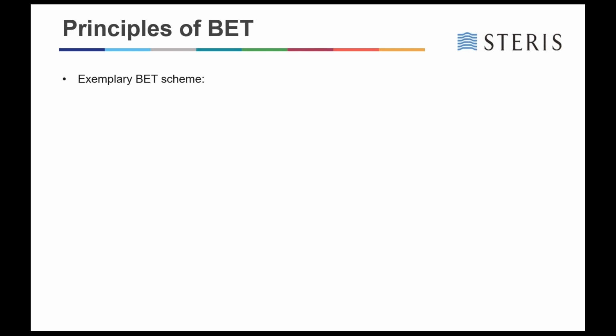Okay, so moving on here, now that we have selection of product, we can take a little look at a scheme that would be used for BET testing. So first you have product handling. And in this scenario, we have the syringe, and the testing portion that's outlined there is going to be removed, and the testing will commence.